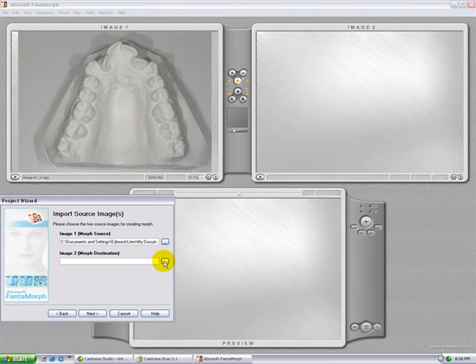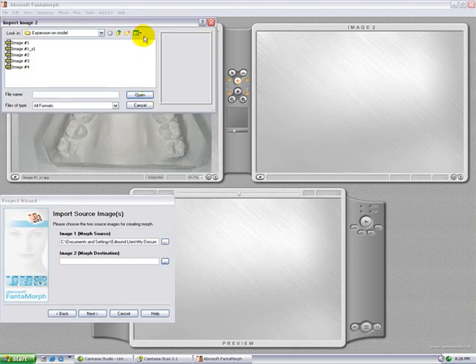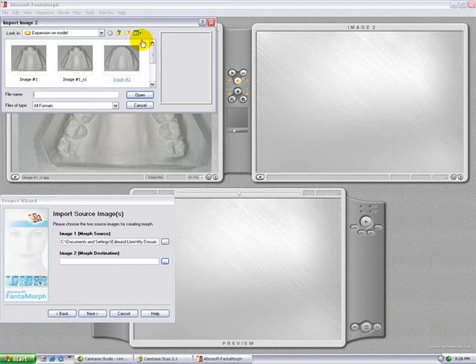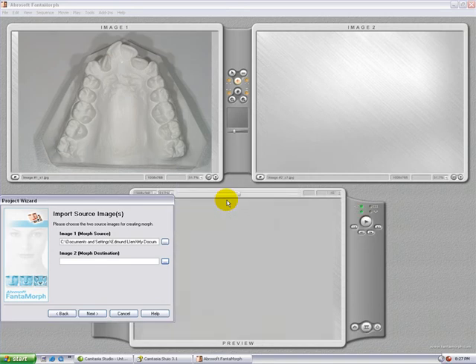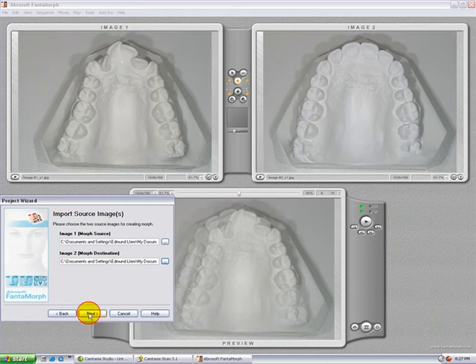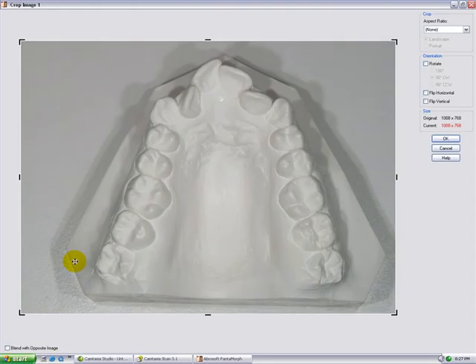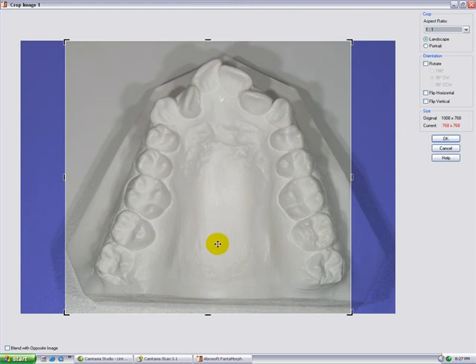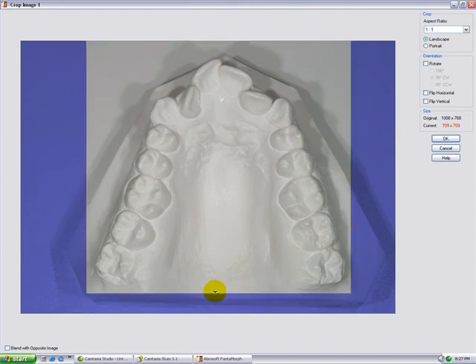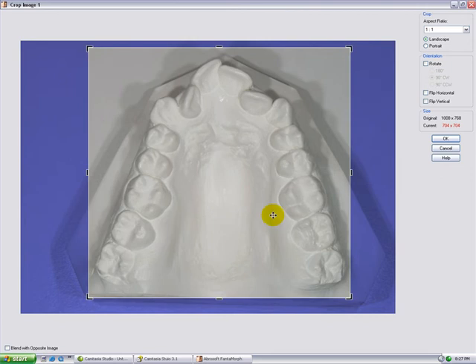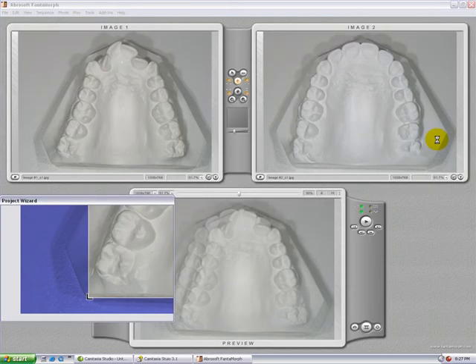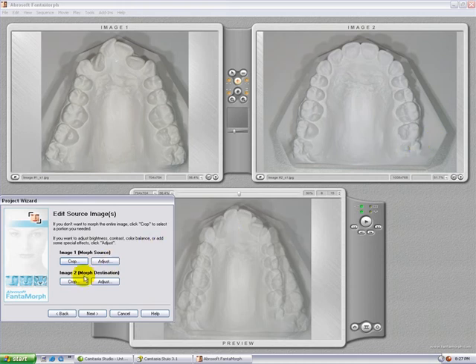Now we're going to import the second image. Click on image. Now we're going to adjust the size. To avoid any distortion, choose a fixed ratio — in this case, 1 to 1. Resize the image and click OK. We'll do the same with the second model.